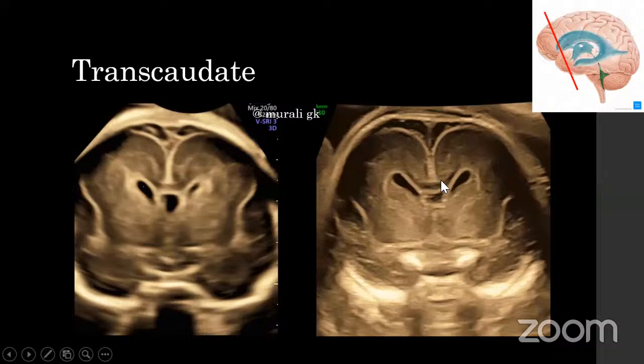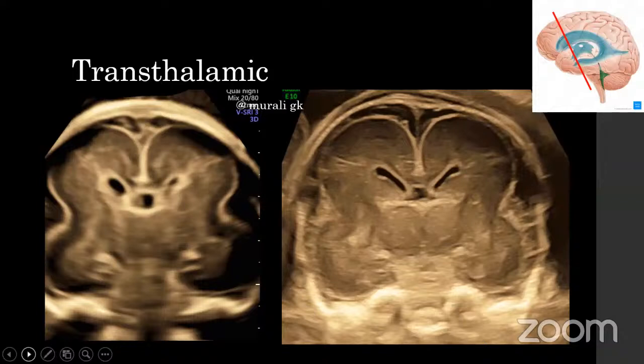And what you see here is the callosal sulci, which is nothing but a pial reflection along the outer aspect of the corpus callosum. Now I go still backward and I am seeing the callosal sulci, the interrupted falx, and the body of the corpus callosum, which is flanked by the frontal horns of the lateral ventricle, and part of the cavum septum. Then I am seeing the two rounded structures, which are the thalami. I am also appreciating the lateral fissure on both sides.